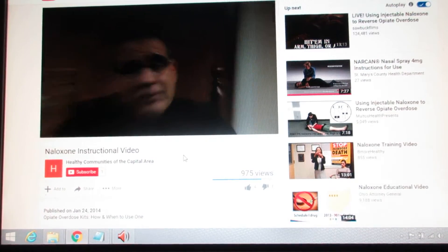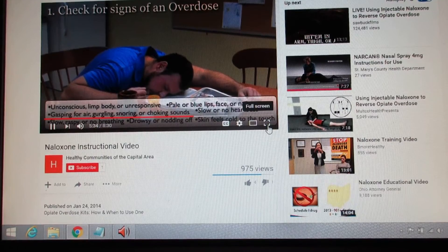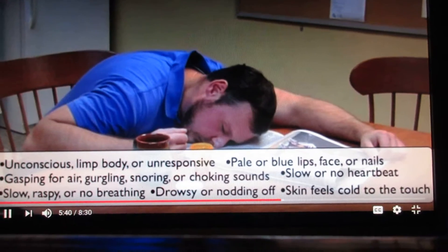Someone uses their kit. Step one: check for signs of an overdose. Is the person unconscious, limp, or unresponsive?